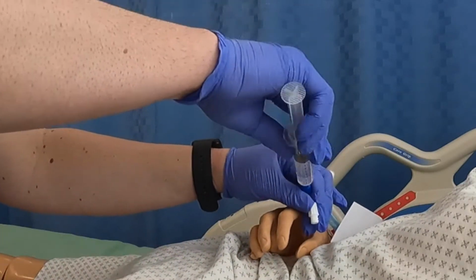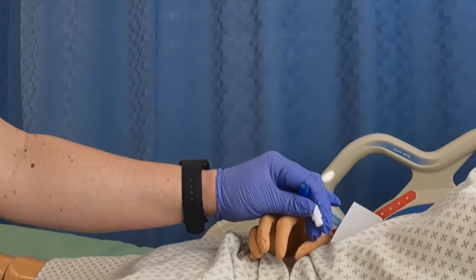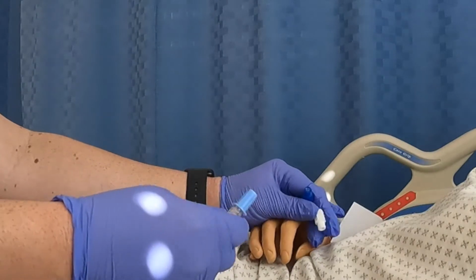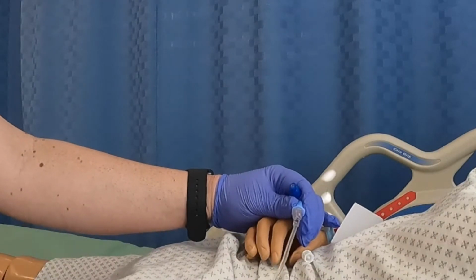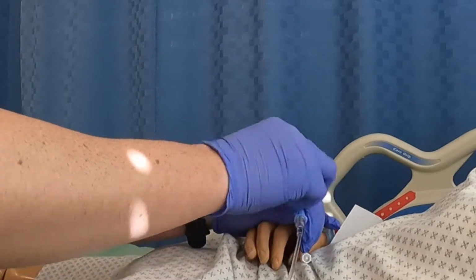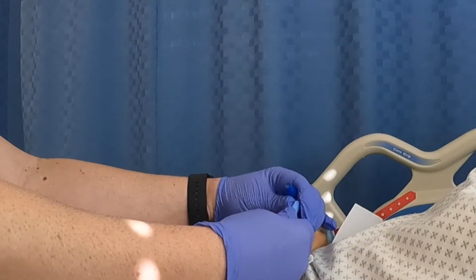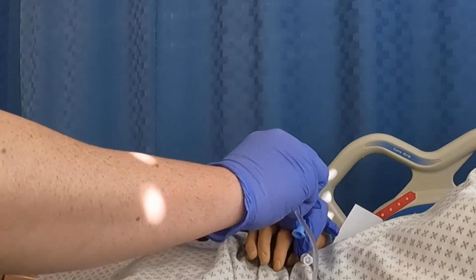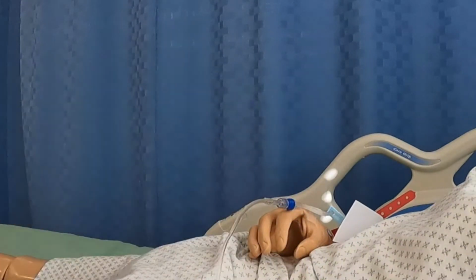So then I'm going to unhook my saline, and you can go ahead and flush it with all 10 if you'd like. And then I'm going to hold this, making sure that I don't contaminate it now that I cleaned it. And then I have my IV solution. Again, I'm going to open another alcohol swab and clean it one more time before I hook it up to my patient. Then I'm going to take off my cap, being sure not to contaminate it. And then you just stick it into the port, and then it screws on. Okay. And then you'll leave it and make sure that it's attached to the patient nicely.